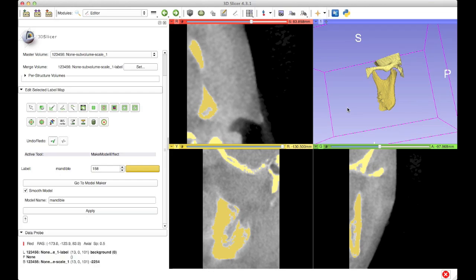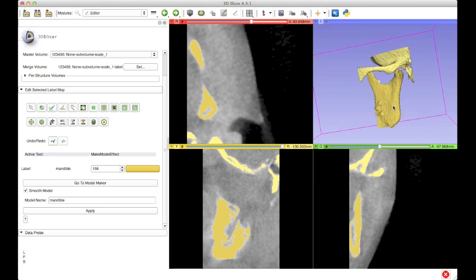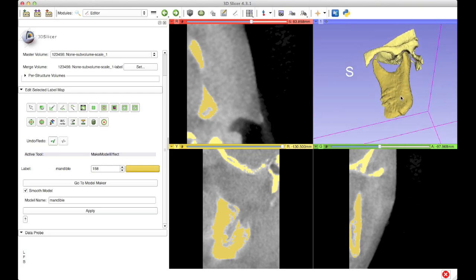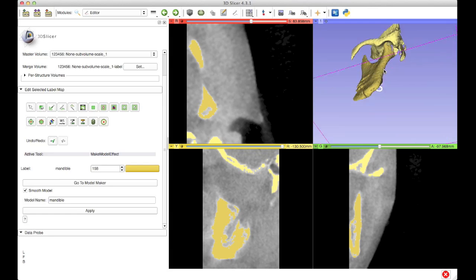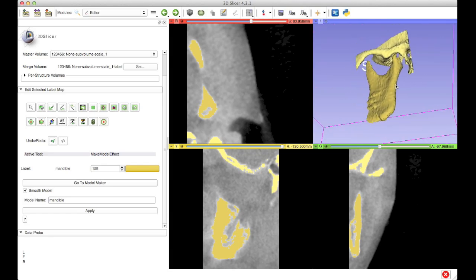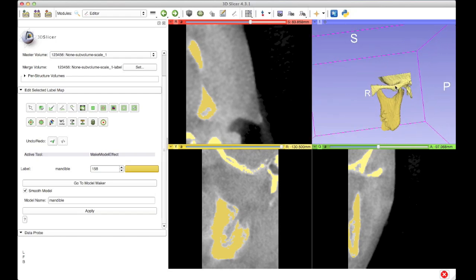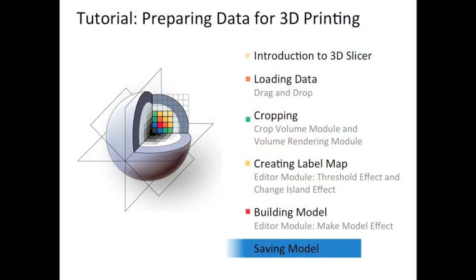Now I have two surface models — one for the superior part and one for the inferior part of the TMJ. I'm going to zoom in so you can really appreciate how the condyle of the mandible articulates with the mandibular fossa, which is this concave depression in the temporal bone. This is a really unique way to appreciate the anatomy of the TMJ, and I'm excited to see it 3D printed. Since I'm happy with both surface models, we can move on to the last step of the tutorial, which is saving these models in a file format that's compatible with my 3D printer.